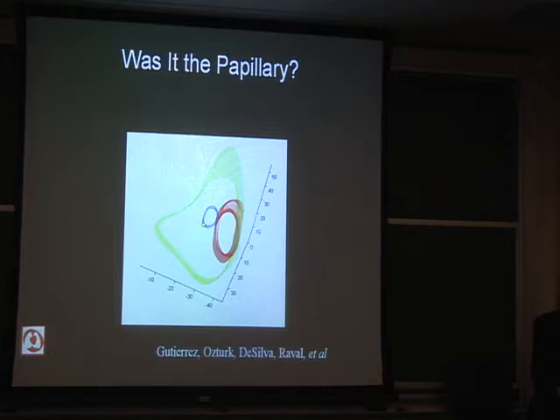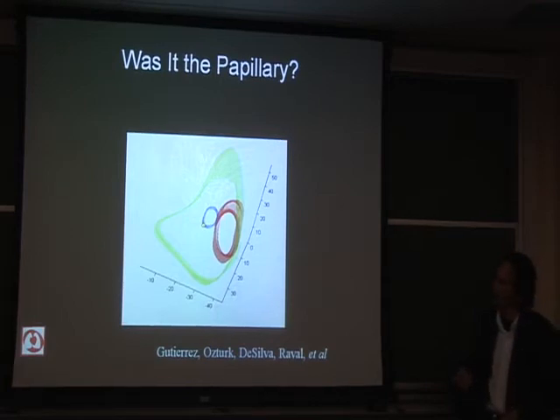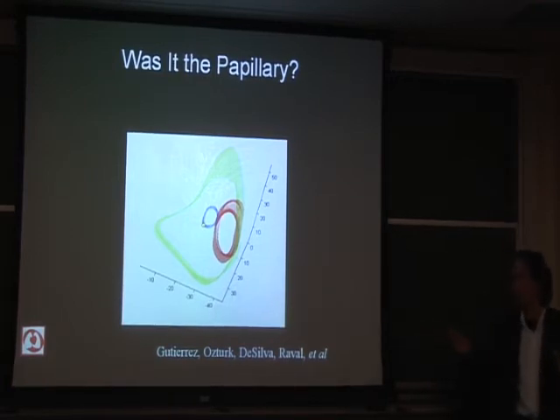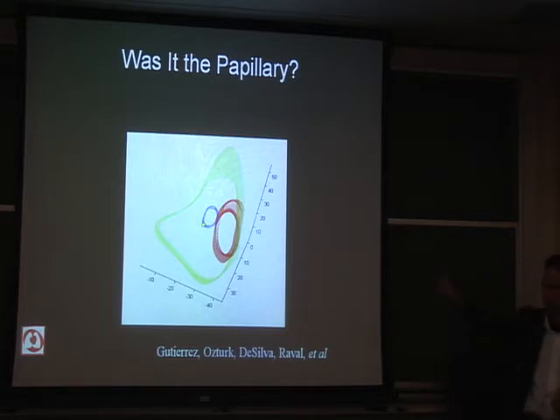So if you manipulate the biopsy catheter with the MR catheter, then you can just do it over MR. The other is, the biopsy catheter is going to be faster, and this should be done in real time, which is where this project is going now, so that they can actually take MR surfaces, bring them into the fluoro space, and when they rotate the fluoro gantry, the MR surfaces rotate with it, and they can see on.